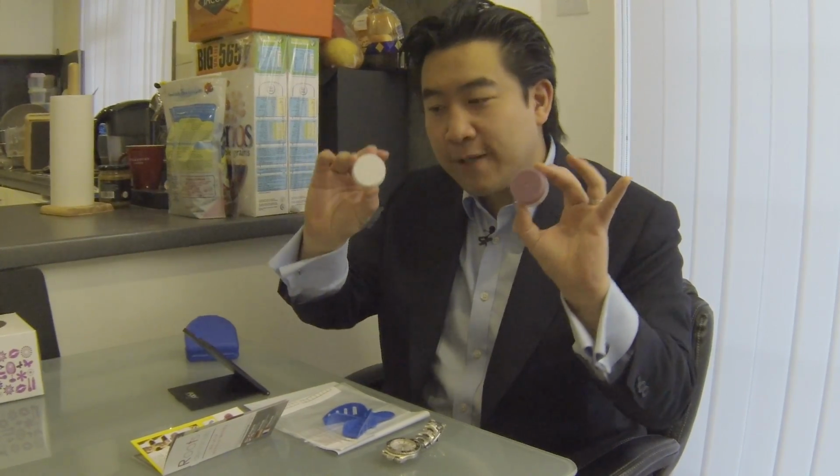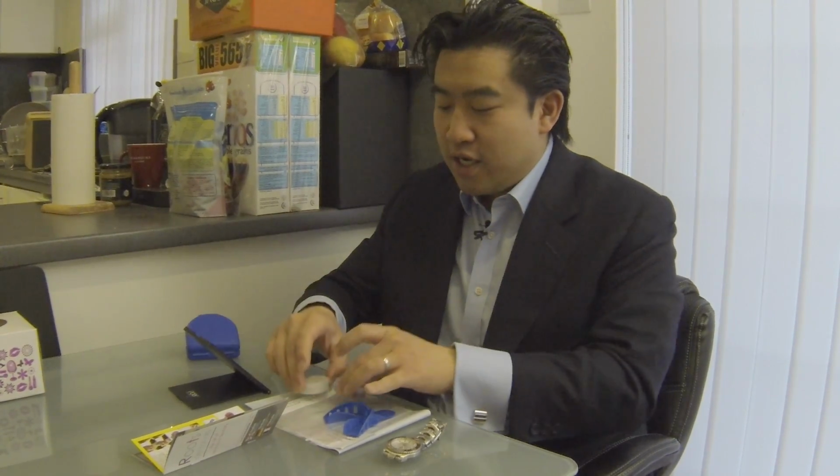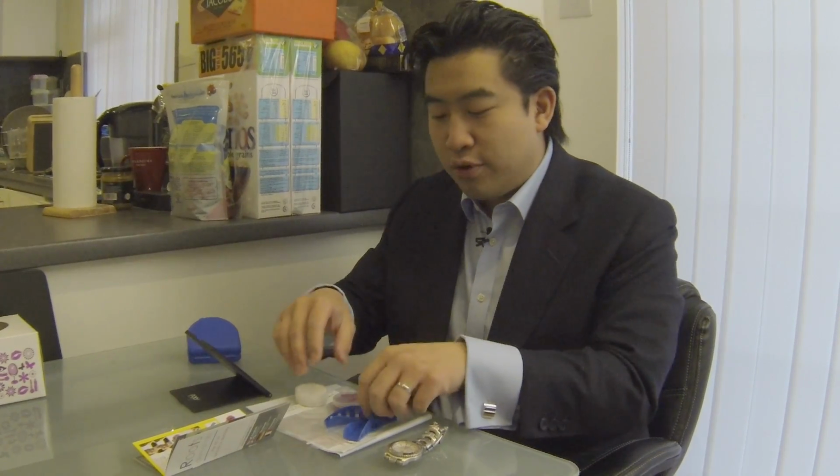Then you've got some putty, some red and some white putty, and basically you take them out of the pots, you rub them in your hand for about 30 seconds, and then you put them in this little tray, and then you stick it in your mouth. You have to align it in the mirror, because when you bite down, that's it, the impression is starting to set. You can't re-roll it or reset it. If you get to that stage, you need to order the kit again, or you need to buy more putty, and they charge you a good deal of money for that.